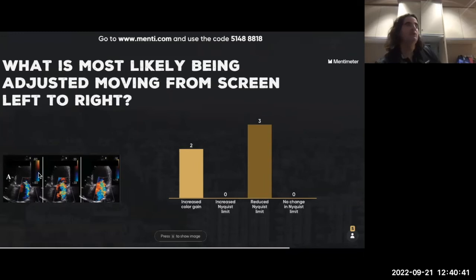So if you look at a blood vessel, even the IJ, with a scale of 60, you may see very little because, of course, the velocity is small, and so the frequency shift would be very small. It may fall within that almost cosine 90, very small degree of shift. So just be mindful of this whole color scale Nyquist limit problem, because that really comes down to how much you can amplify that noise.